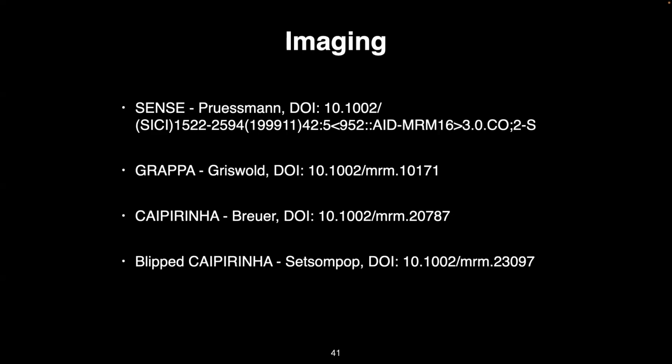There are cases where an imaging protocol that will work on most people may not work for somebody else, because they have some differences in their anatomy, their nerve or muscle fibers. Maybe they're more susceptible to having these long conductive paths where these switching gradients can induce currents that they may feel. So in this case, you should always leave it up to your subject if they want to continue or not, if they're comfortable, because it is always at their discretion.